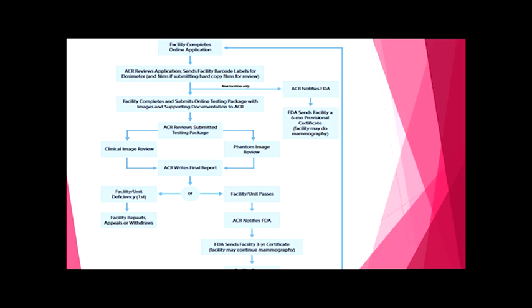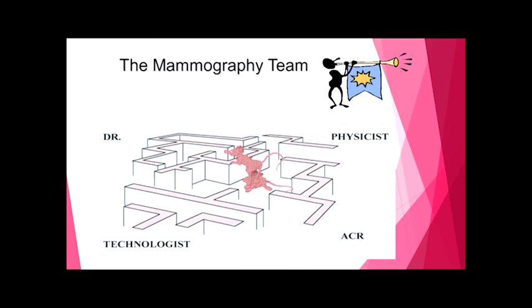But once you're up and running and you have all of your equipment, and the equipment issues aren't that great, where we're seeing problems are in the clinical images. And the majority of the program will be talking about the parameters and how we can improve those. So it is a process. Somebody in your facility has to keep up with all of the things that have to be done.